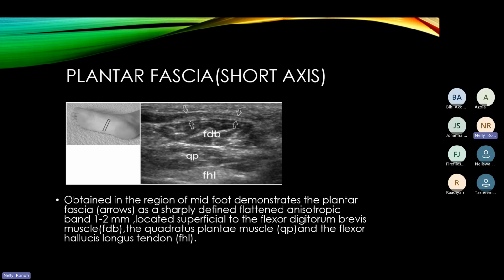So overextend their toes while the foot is in this position. You can ask them to actually push their toes back so that it is able to bring the foot as parallel as possible, because there is that medial arch. So then, of course, this is how we also check. We said we check in two planes. We have the longitudinal plane, and then you'll also have to check on the transverse plane.